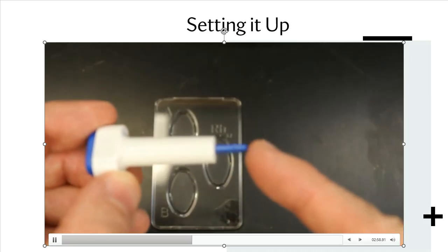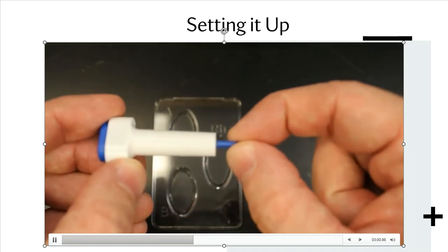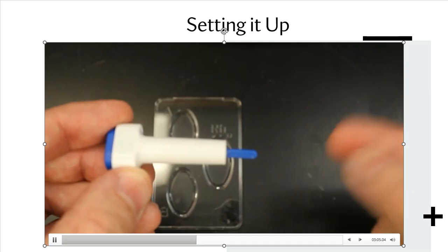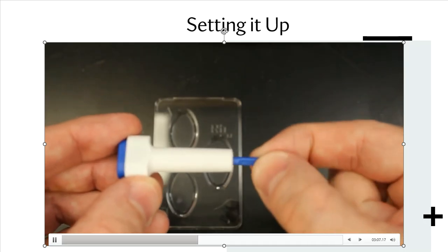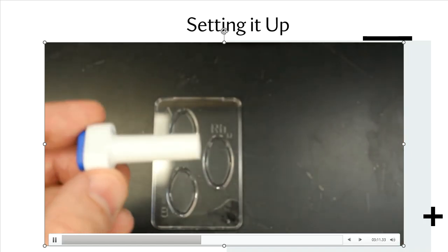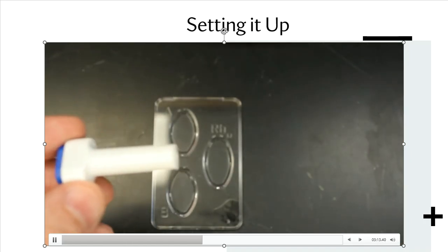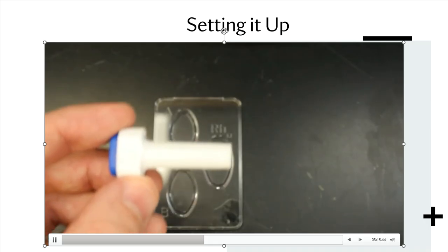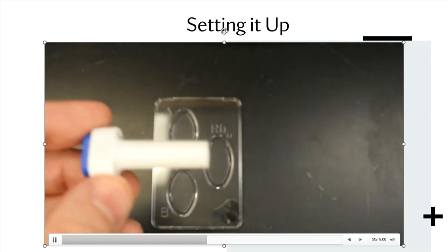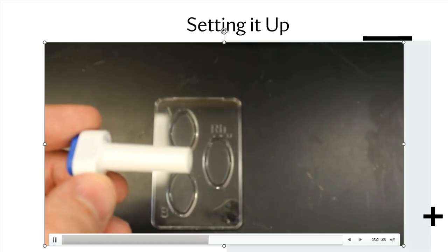So the best way to remove these plastic tips is to grab a hold of them and give them a twist. When you twist like that, you will feel it loosen up, and then you can pull it on out without any force or anything pulling against you at that moment. So my needle tip has not been dislodged. It's still in there.